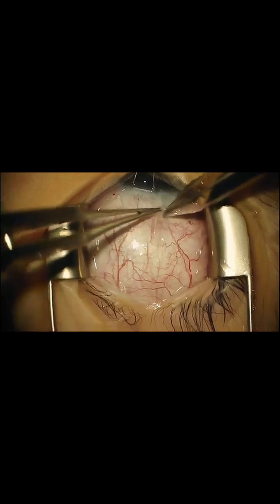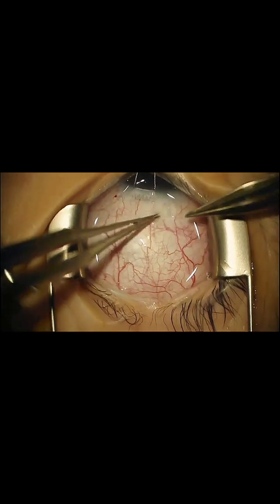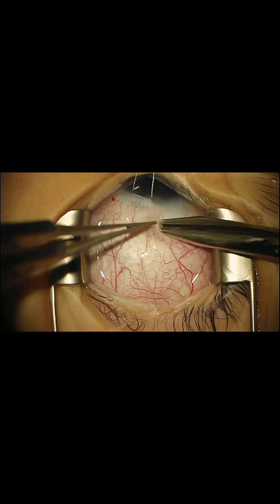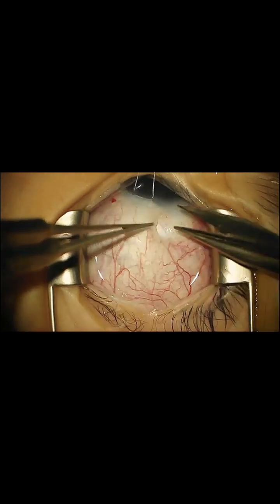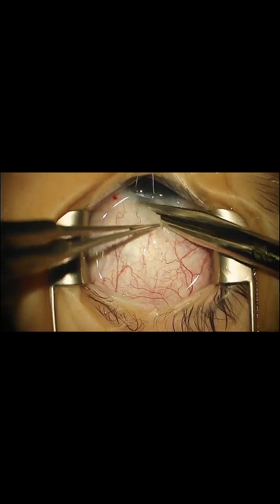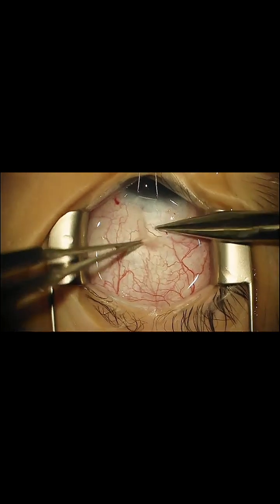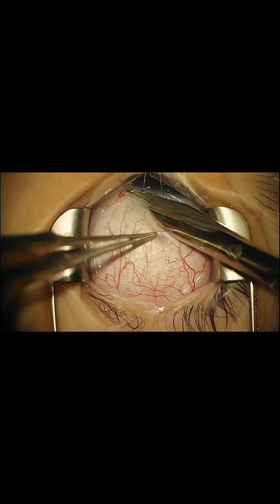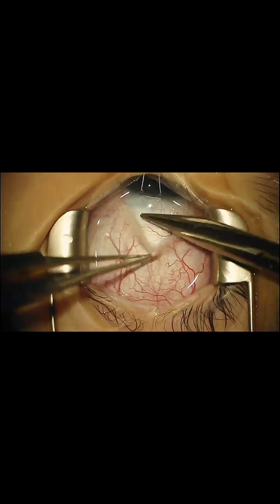So we have a couple options here. You can do the trabeculotomy from the top at the 12 o'clock or temporal. Those are the most common positions. I'm choosing to go temporal so that this is the conjunctiva that will be disturbed. If the child needs another procedure such as trabeculectomy or tube shunt, we'll still have normal conjunctiva superiorly to work with.